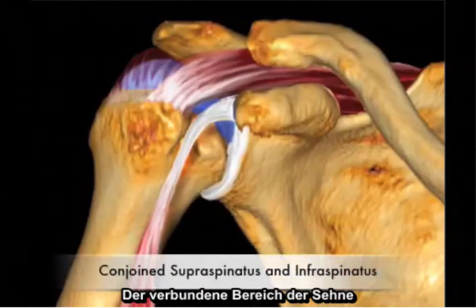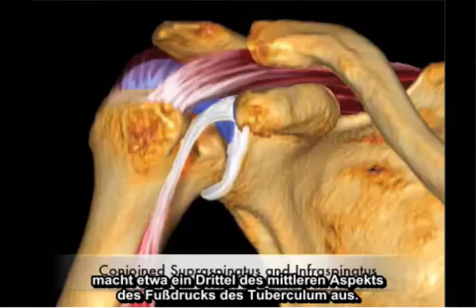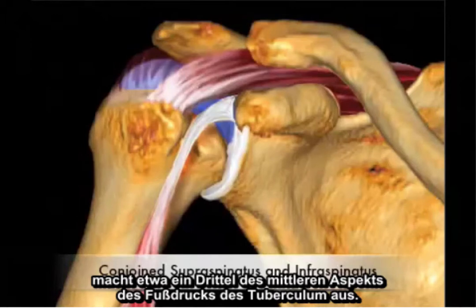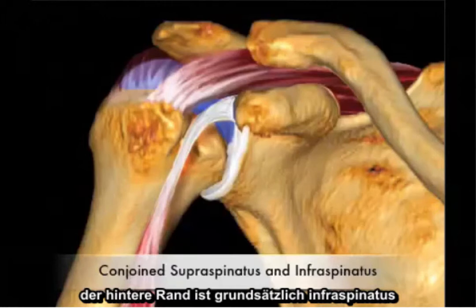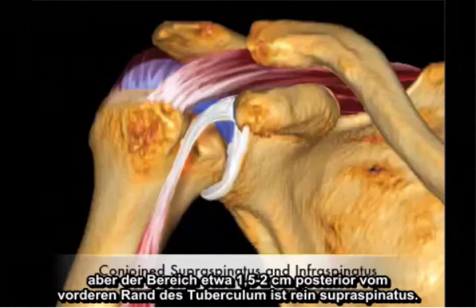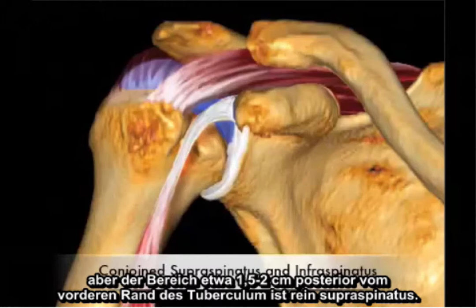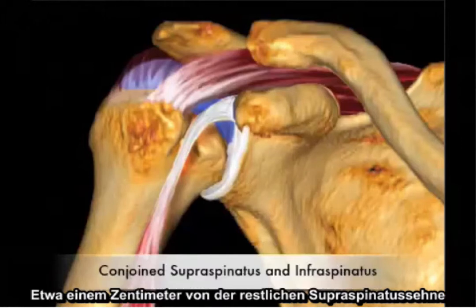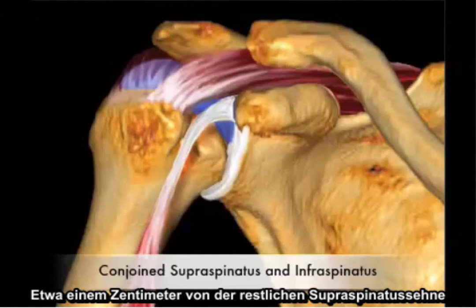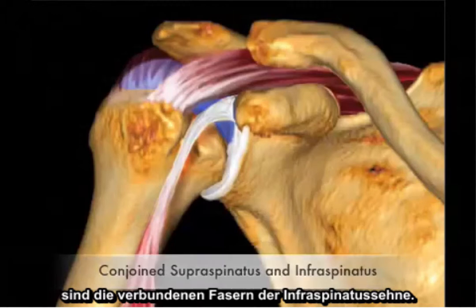The conjoined portion of the tendon makes up approximately one-third of the middle aspect of the greater tuberosity's footprint. The anterior margin is strictly supraspinatus, the posterior margin is strictly infraspinatus, but approximately 1.5 to 2 centimeters posterior from the anterior margin of the greater tuberosity is purely supraspinatus. Approximately 1 centimeter of the remainder of the supraspinatus tendon is actually conjoined fibers of the infraspinatus tendon as well.